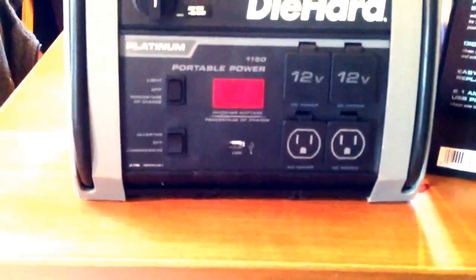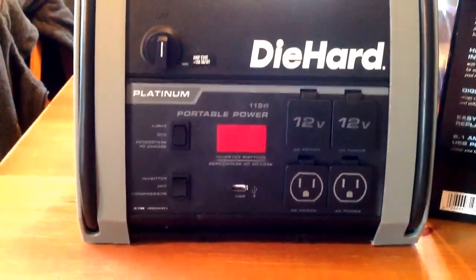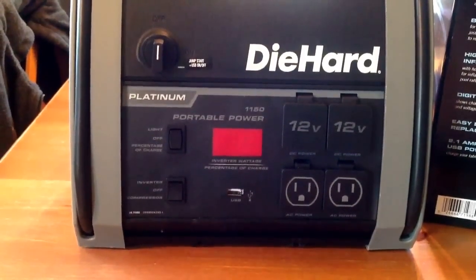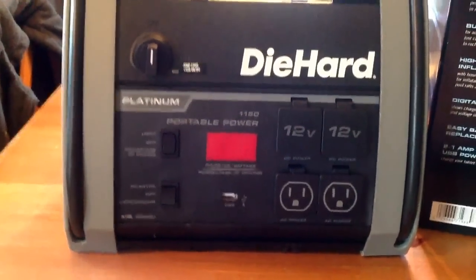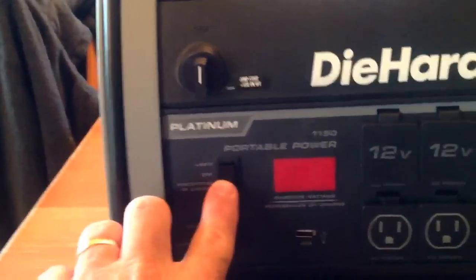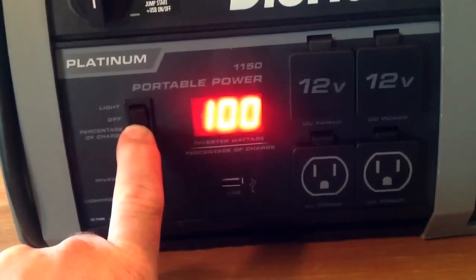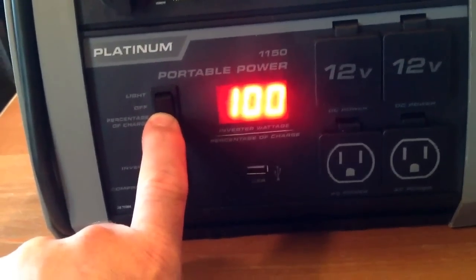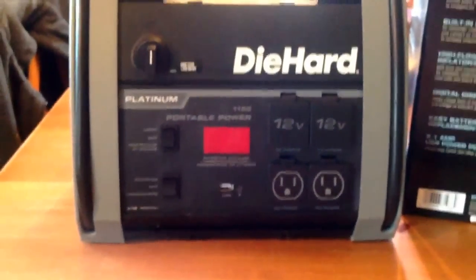If it doesn't seem like it's charging well after a couple days, or if it doesn't seem like it's keeping the charge, even if you unplug it and not use it. In other words, if it says 100%, and then you unplug, see this right here? You can tell by pushing this button down. If that says 100%, and you leave it unplugged and not use it, and the next day you come back and it's 91%, then you can say, hey, you know what? This thing isn't storing a charge. Bring it back right away with your receipt.